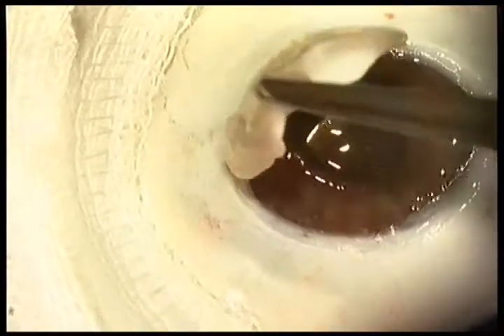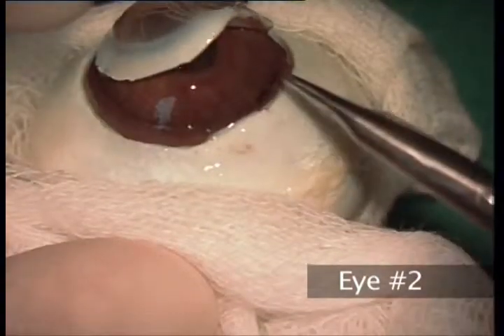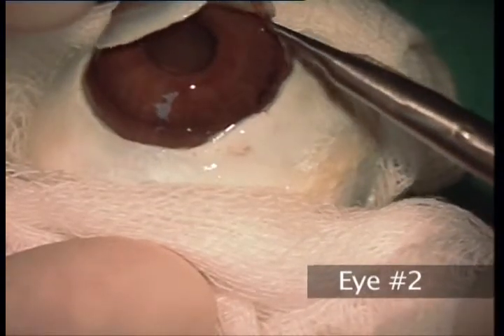When the donor button is withdrawn, we can see the clock-like disposition of the sclerocorneal junction. The extracted cornea is introduced in Optisol for some hours, and then is transferred to the tissue C medium to keep it warm.